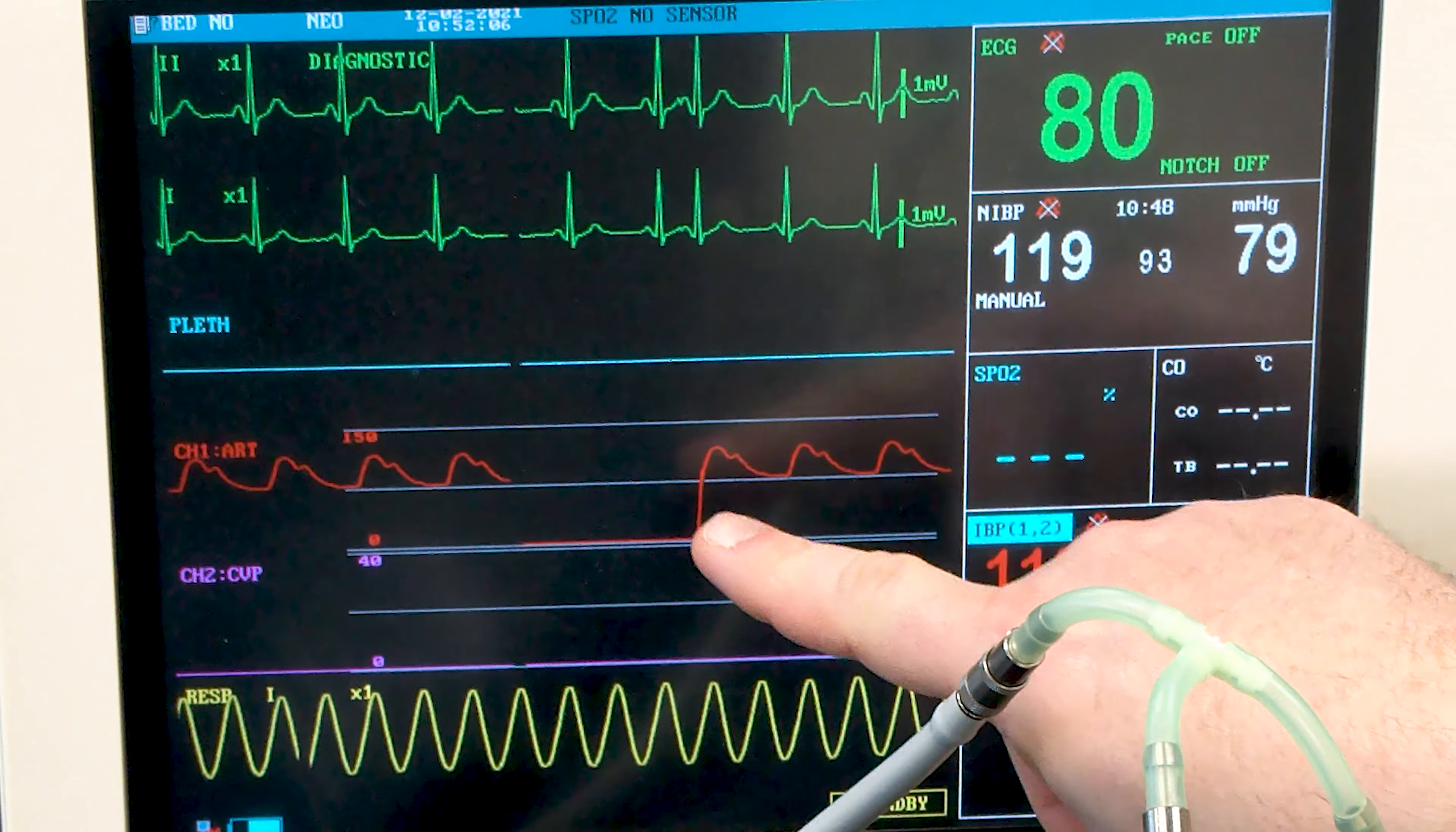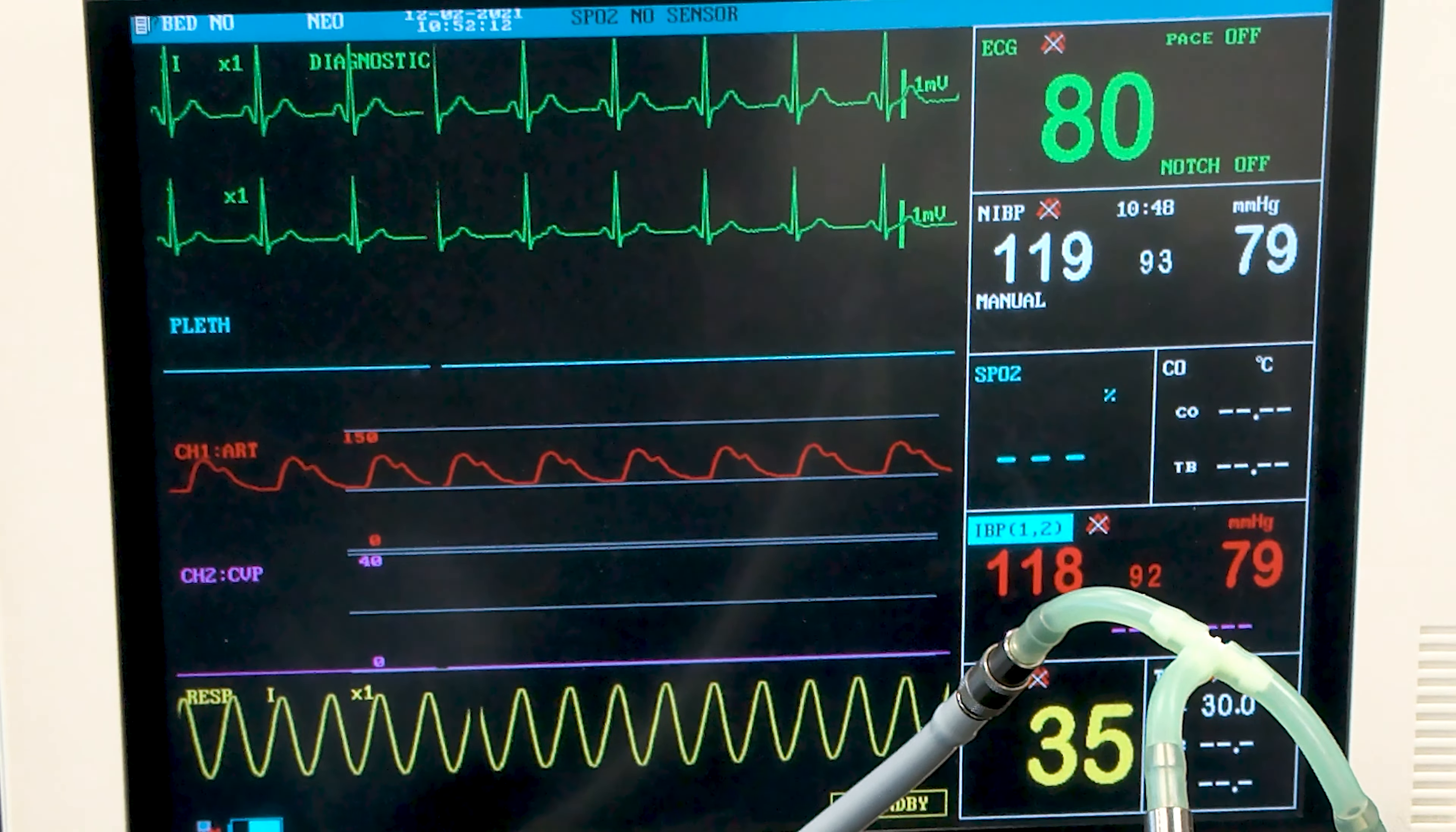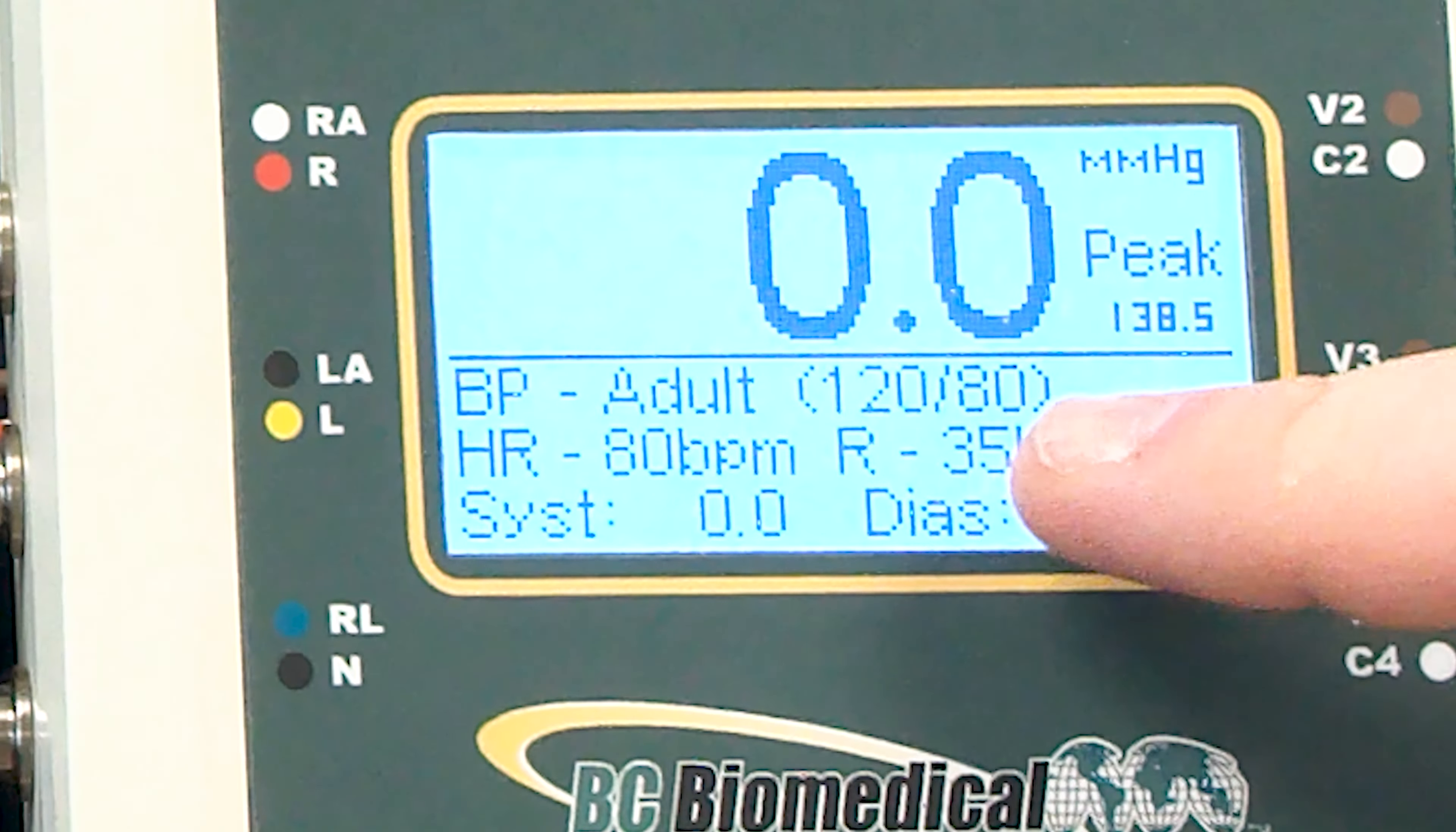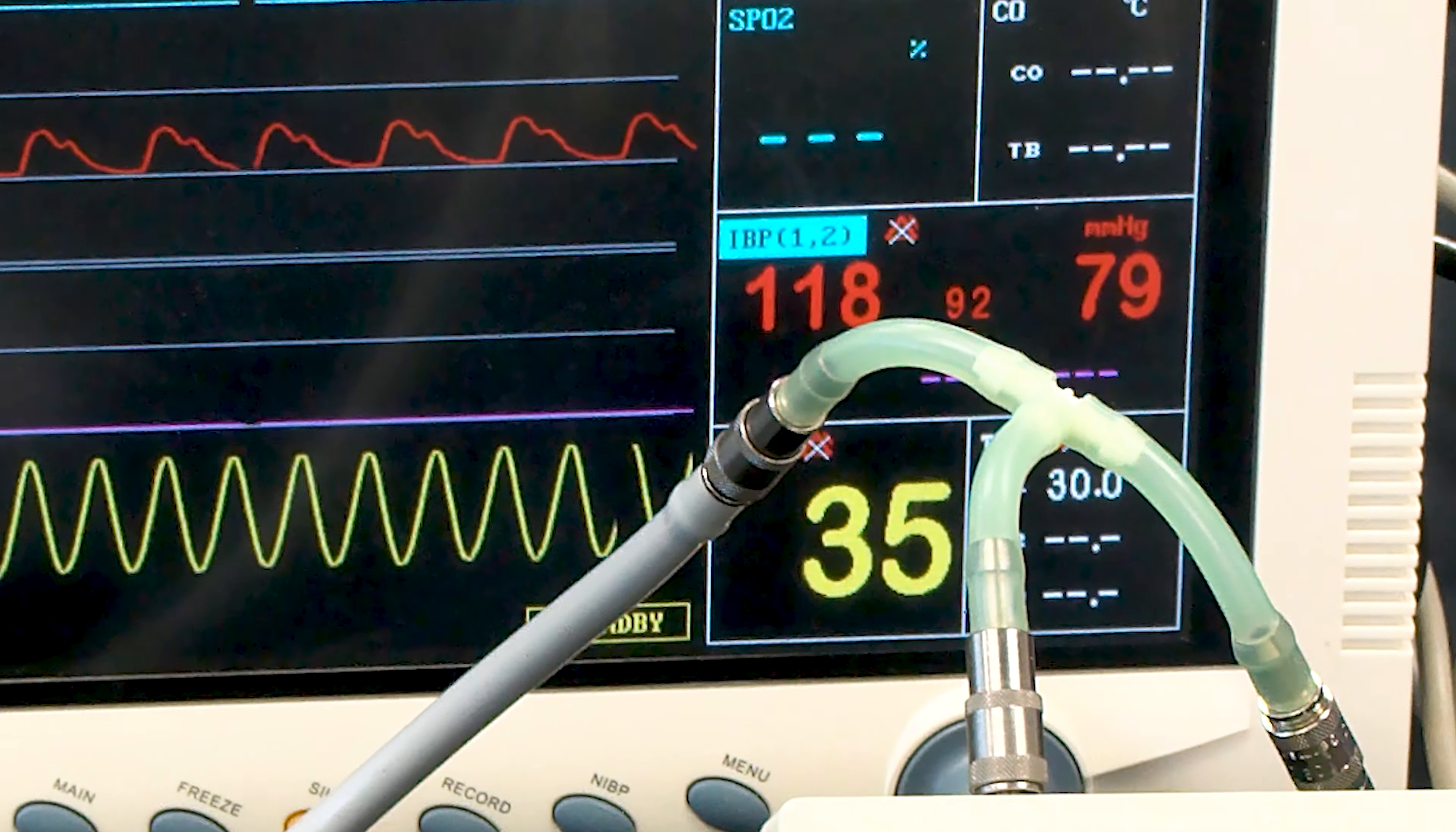we'll be simulating dynamic blood pressure that is synchronized with the ECG and the NIBP pulses. So here we have set for 120 over 80 for the NIBP and the IBP as well, and in this case we have 118 over 79 displayed on the monitor.